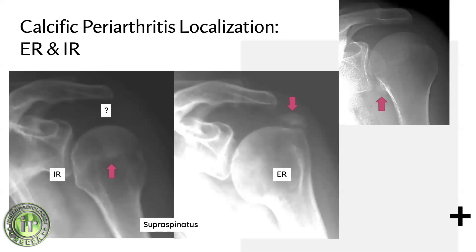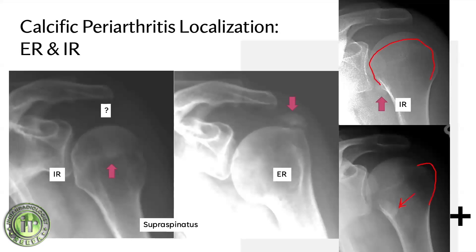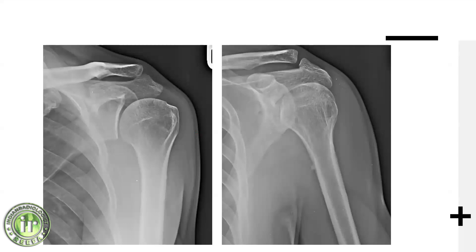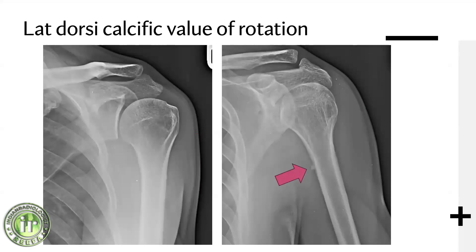Contrast that with a case showing a globular calcification near the axillary recess on an internally rotated view. When you do the external rotation view, the calcification moves laterally - this tells you the calcification is sitting in the subscapularis. In another case with excruciating pain and nothing visible on external rotation, the internally rotated view clearly reveals a small calcification that turns out to be at the latissimus dorsi attachment - a latissimus dorsi calcification. This demonstrates the importance of rotation views.